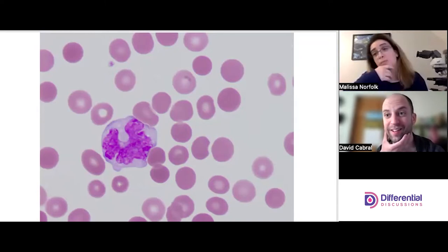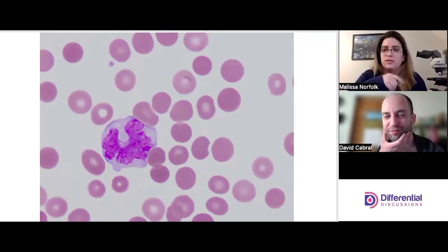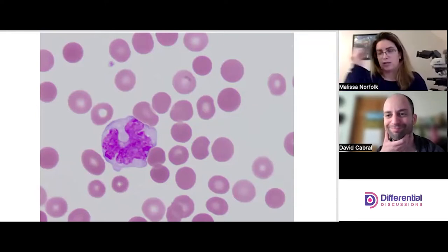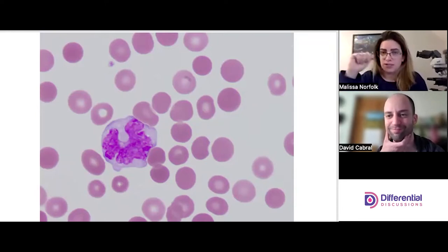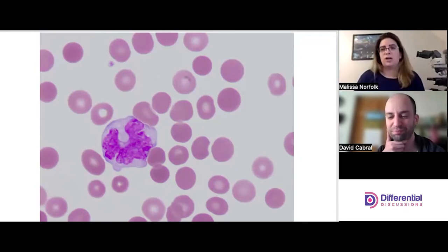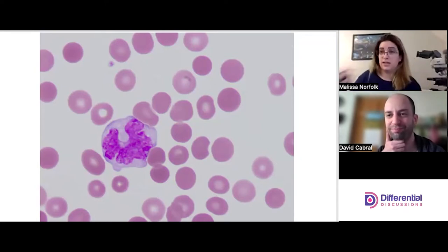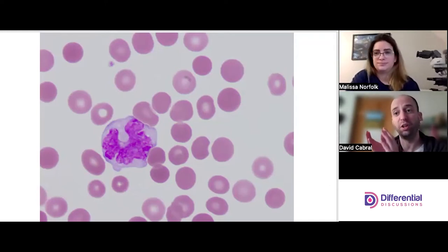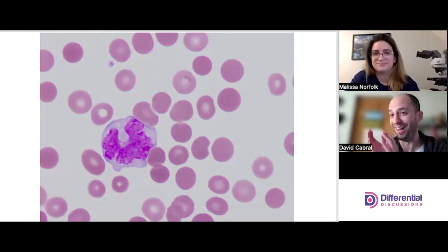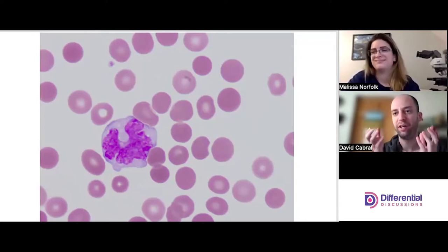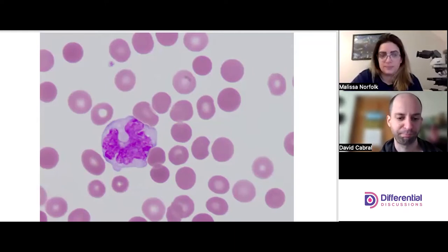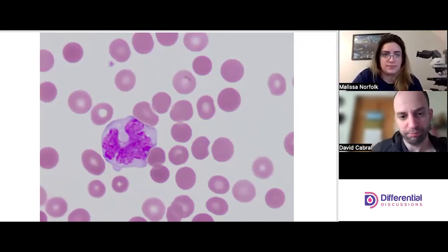Notice how we didn't just say 'because it's a horseshoe it's a mono' — we went through the whole picture. When you're evaluating monos, especially in the beginning, you need a checklist in your head: how does it look when interacting with other cells, what does the cytoplasm look like, what's the shape of the nucleus. It's nice when all the evidence goes to one side, but you'll see as we move through this there's going to be push and pull.